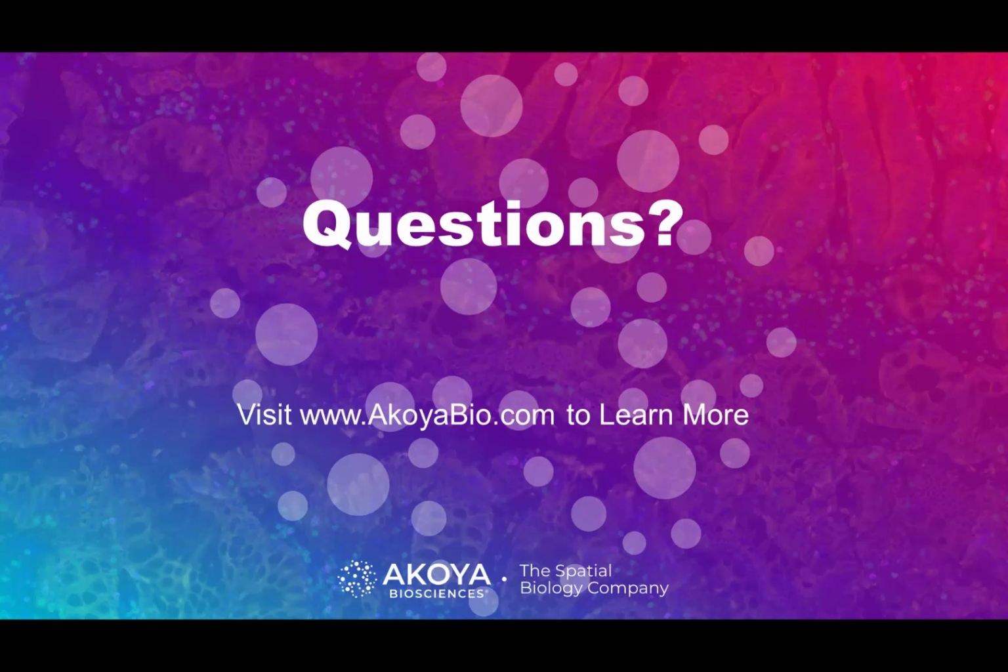Most likely going to be yes. We've really done most of our work with FFPE tissue, since that's kind of the majority of what we have. We're getting more into frozen right now. We do know there are differences in the antibodies, so they have to essentially be re-optimized again in frozen tissue. So I don't have a great answer for it yet, but it's something we're working on a little bit more. But again, most of our tissue is fixed, so we typically focus on that for these initial analyses.